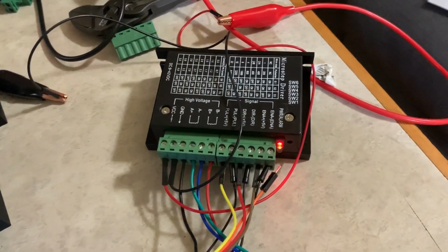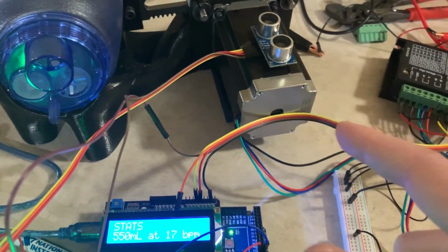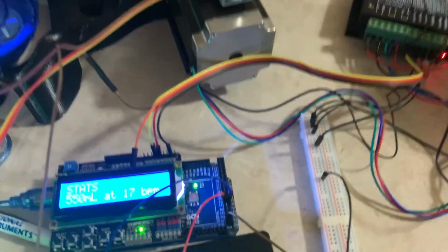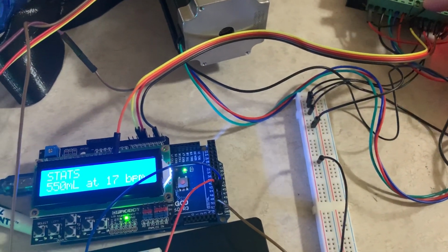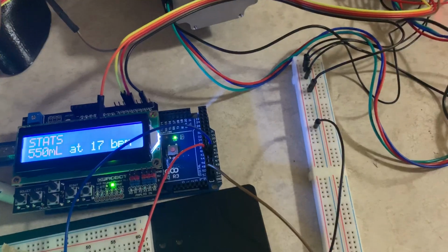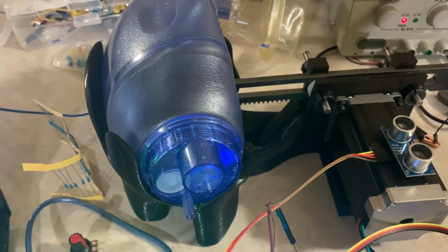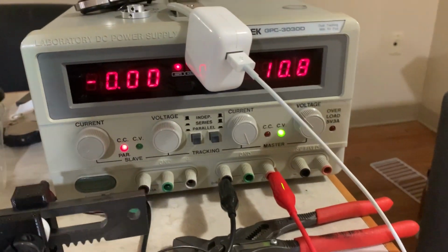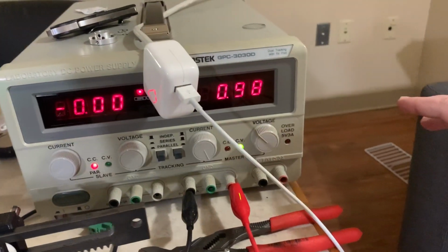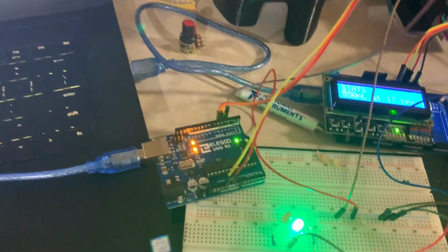without hurting themselves. And so the inputs to the stepper motor driver, which actually drive the stepper motor, there are three. The first one, the enable pin, is connected to the smaller Arduino and the ultrasonic, so that if a person puts their hand there, it triggers that and it turns off the motor. And the other two are the direction and the pulse, which are controlled with this Arduino as far as just how far the rack and pinion is moving and all of that, and how fast it's moving. And it takes in 10.8 volts, a little under 1 amp nominal, and that seems to be it, I think.